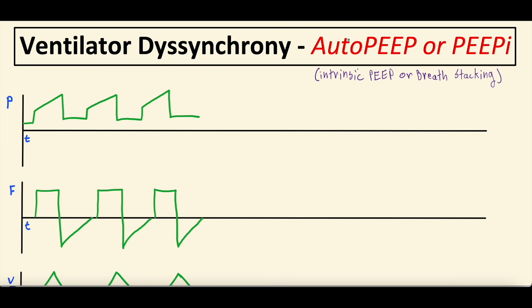So to get started, auto-PEEP or intrinsic PEEP or breath stacking or air trapping, I should say. PEEP with the little i after it stands for intrinsic PEEP.